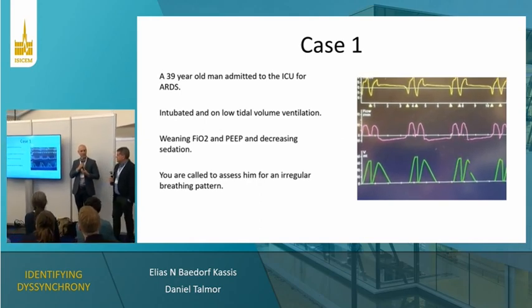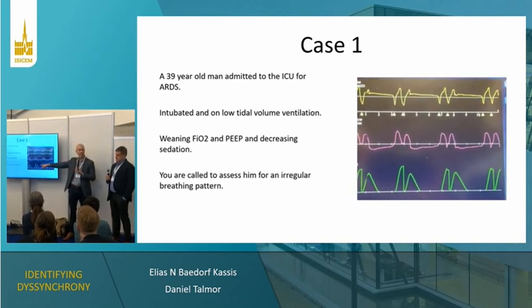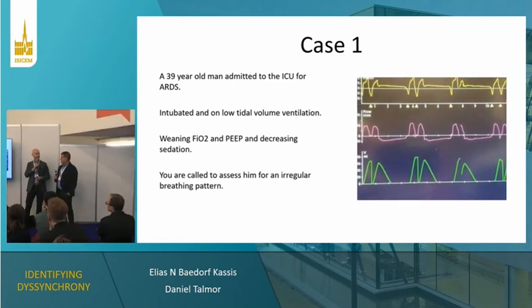And one of the things we wanted to point out here is that the ventilator, and all ventilators really, do a very poor job of identifying this because of the fact that it re-zeros the volume. So any breath stacking event can be really more challenging to see than oftentimes we expect because of that.